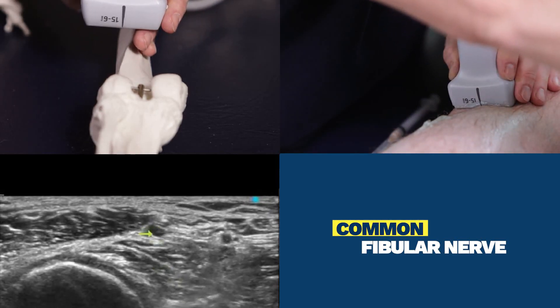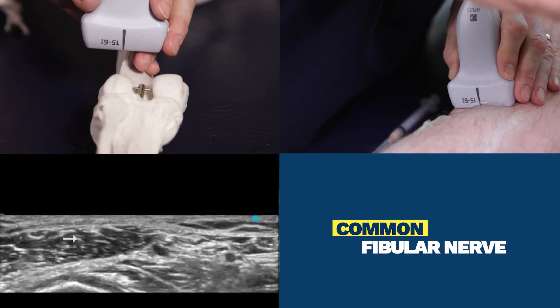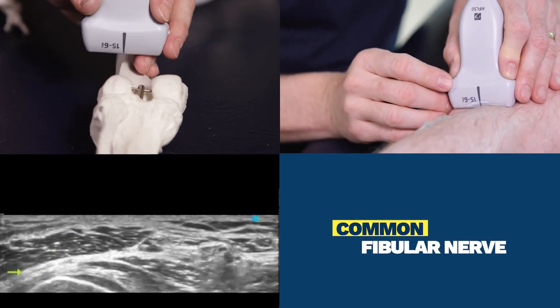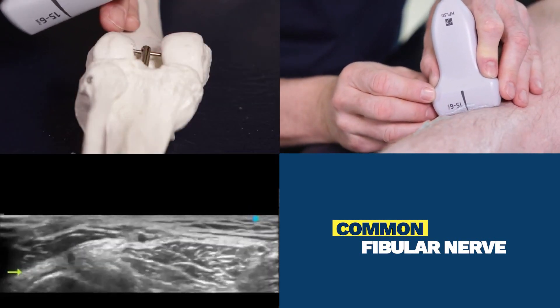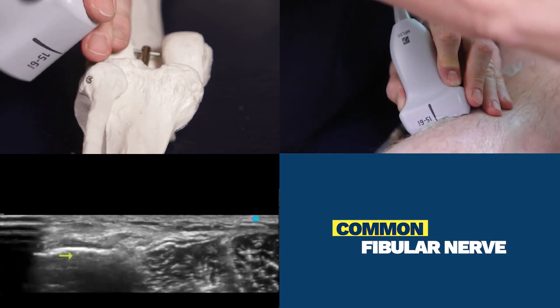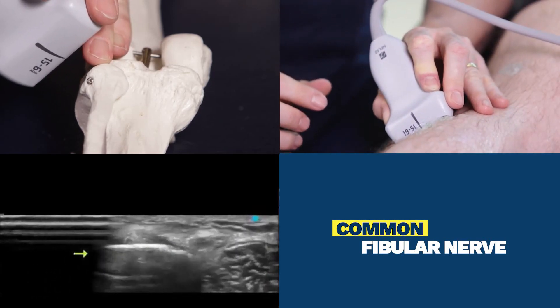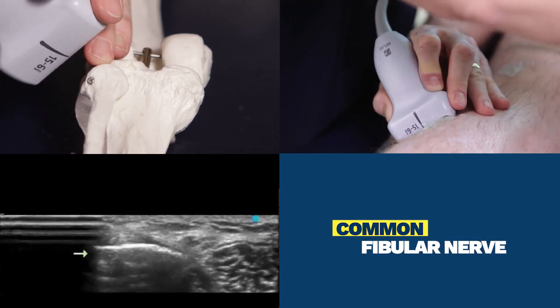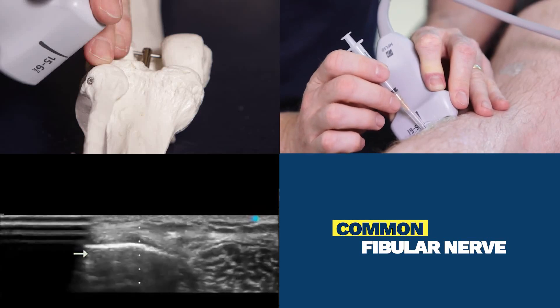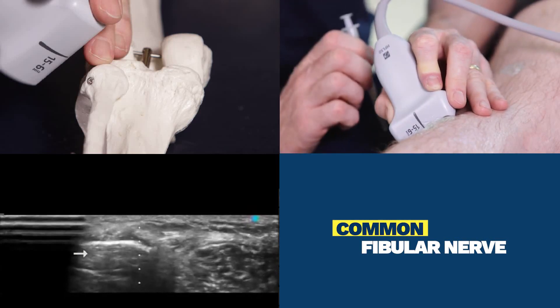As I scan distal you can see the one nerve now turn into two. There is our common fibular nerve. We're now going to follow this down to the fibula. If I decrease my depth it will improve clarity of the imaging. Here is the common fibular nerve sitting adjacent to the posterior fibula. If I then place my probe like this, I can turn on my center line and simply place the needle from posterior to anterior and do a perineural common fibular nerve injection at the posterior aspect of the fibula.